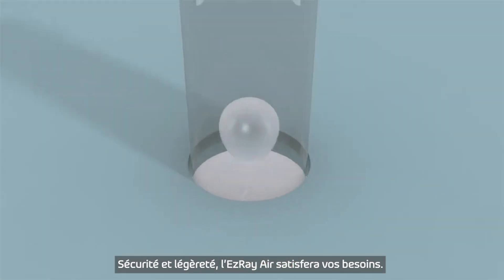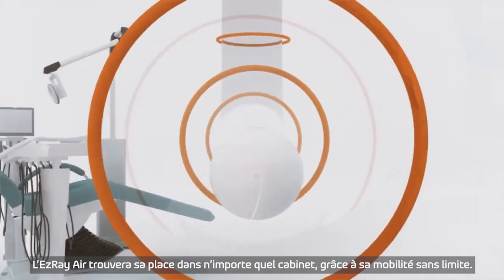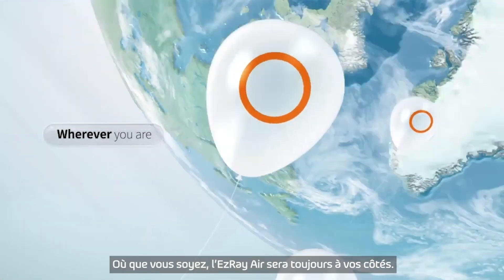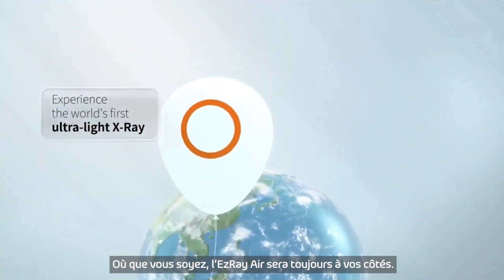EasyRay Air will accommodate your needs. Let EasyRay Air enhance the mobility in any dental practice. Wherever you are, wherever you go, EasyRay Air will always be on your side.